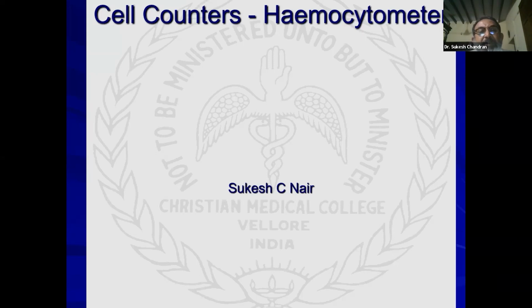But most people only look at the counts and report on the counts. Maybe they look at the peripheral smear. The peripheral smear is an artifact because you make a smear. The spread of the cells is based on the weight of the cell and its attached affinity to glass. So it's an artifact, and you're trying to correct something which has been objectively derived from the cell counter with your peripheral smear. So I just wanted to go through some of these hemogram interpretations to convince you: please look at more than what the cell counter does.